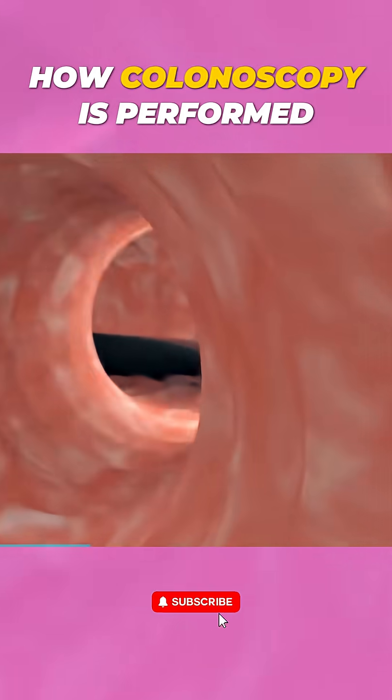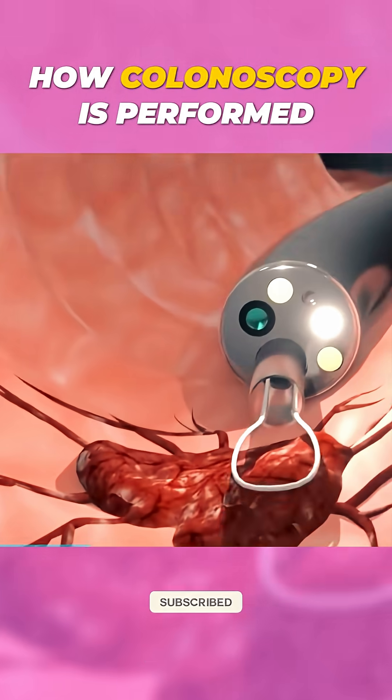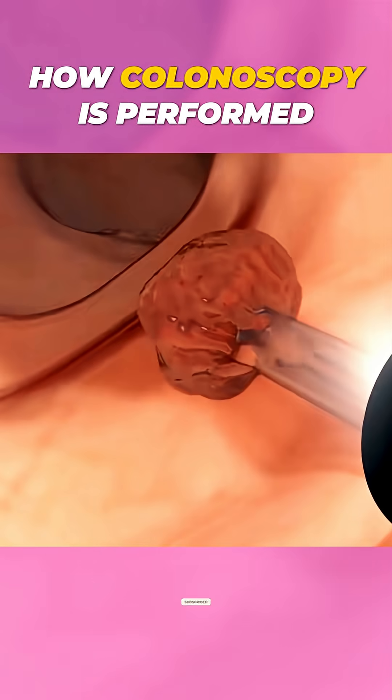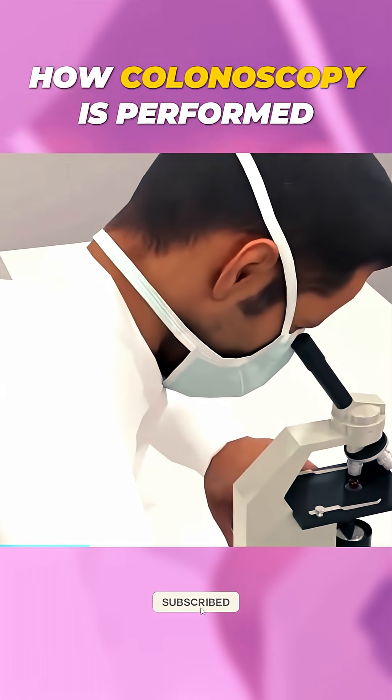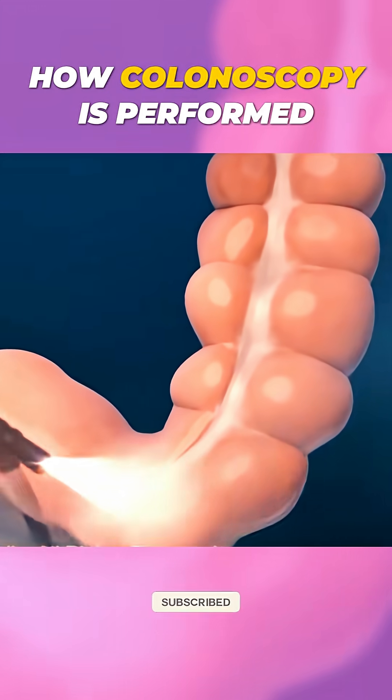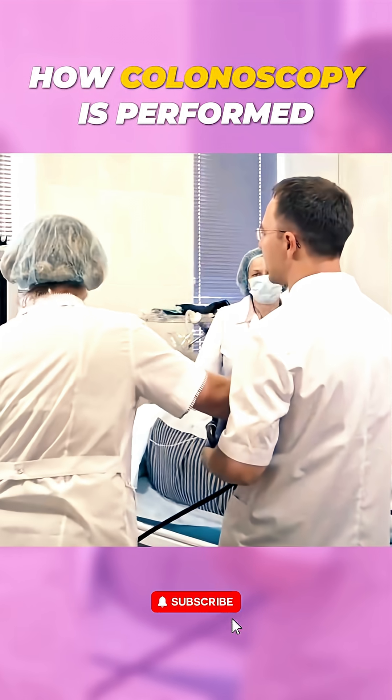If any polyps or suspicious growths are found, the doctor can remove them right away using special tools attached to the colonoscope. These are then sent to a lab for further testing. The entire procedure typically lasts 30 to 60 minutes, after which the colonoscope is removed.